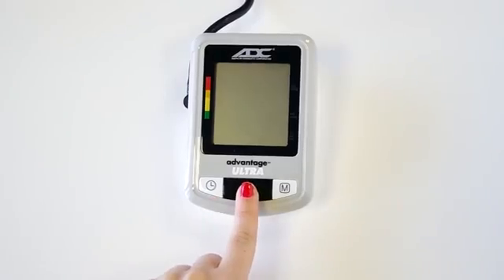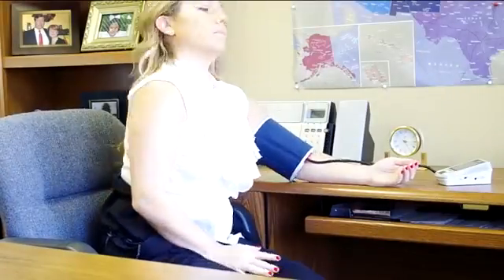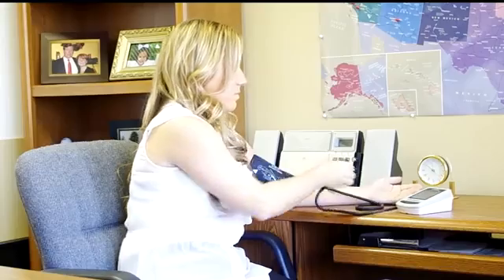To begin the measurement, press the power button. For automatic models, the cuff inflates on its own with a push of a button. If you have ADC's semi-automatic model, you will need to press the on-off button and then pump the bulb with your other hand to begin the measurement. All models will deflate and take a reading automatically.